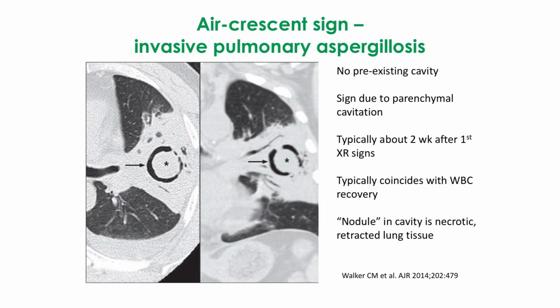So we should be very clear about this, and as usual, context is again everything. So here basically there's no pre-existing cavity to talk about. You are not talking about this saprophytic colonization, right? And the cavity is due to parenchymal cavitation.